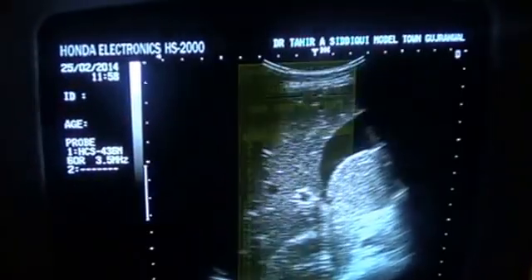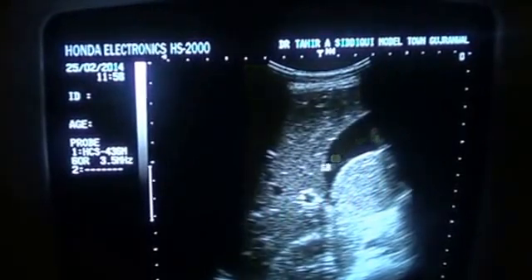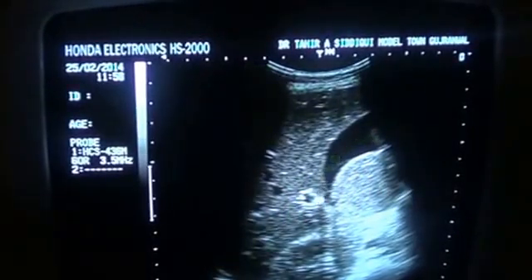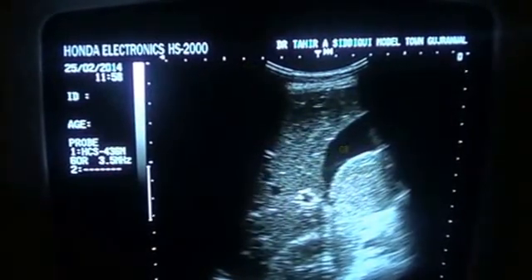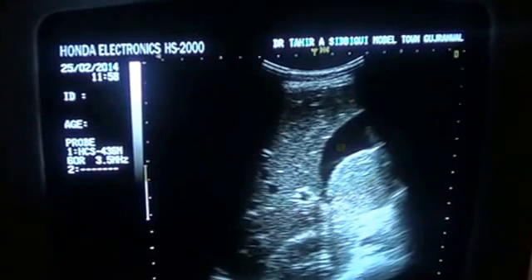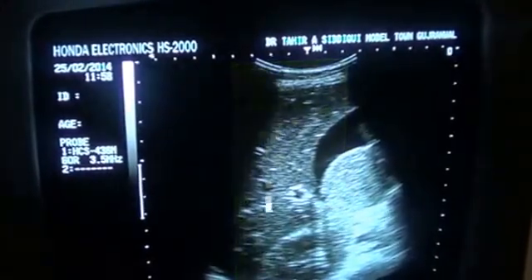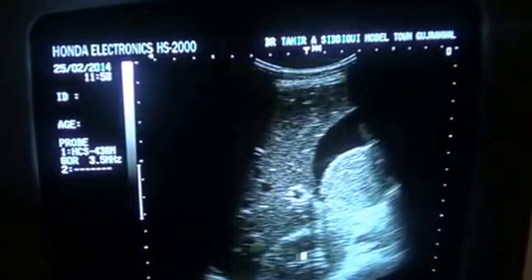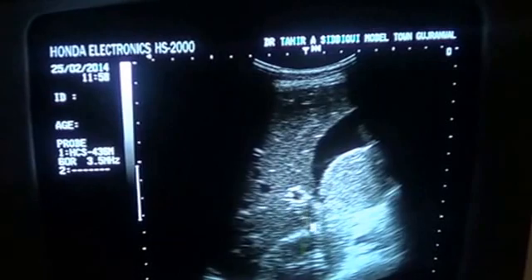This is the gallbladder. This is the liver. This is the kidney — the right kidney.